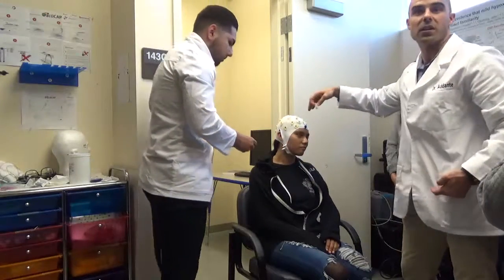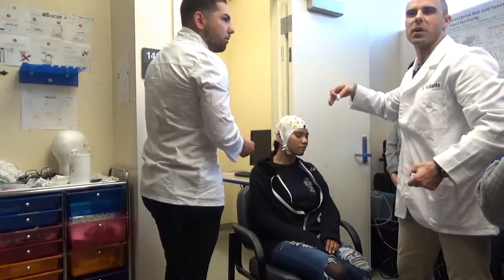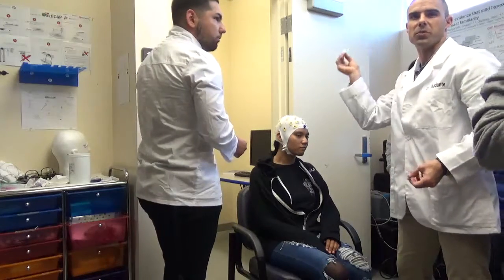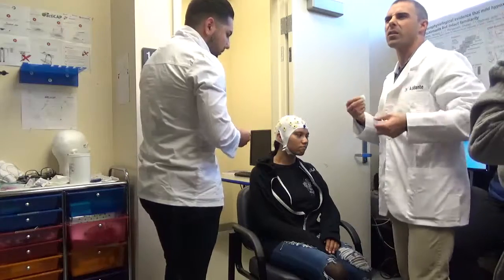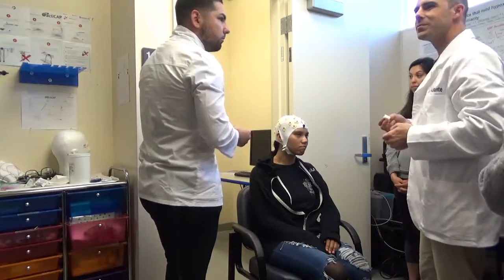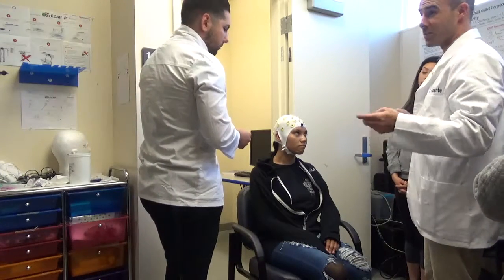Now I rushed ahead and I just put the cap on because I wanted to save some time. But usually you would do this before you put the cap on. You would attach the electrodes here before you put the cap on. But we're just moving along. Should you close your eyes first? Oh, close their eyes first, of course, yeah.